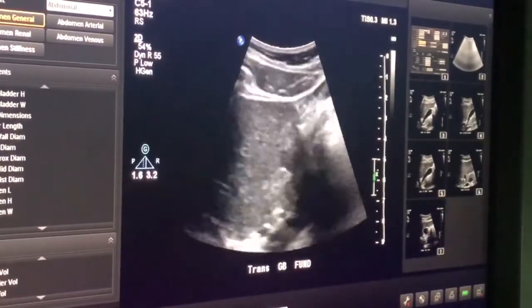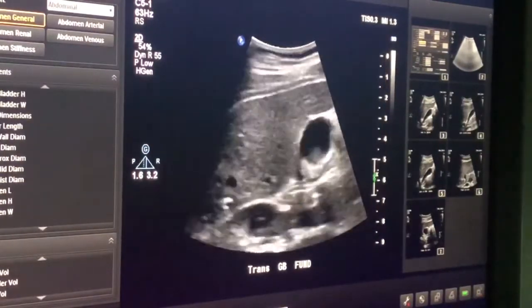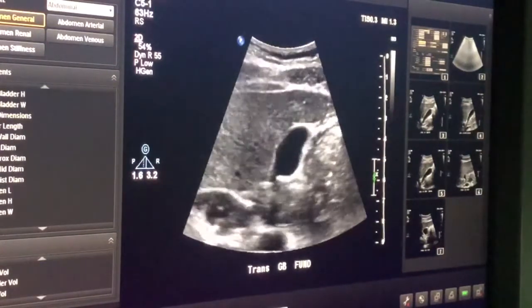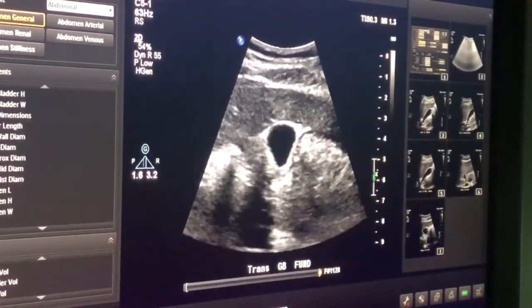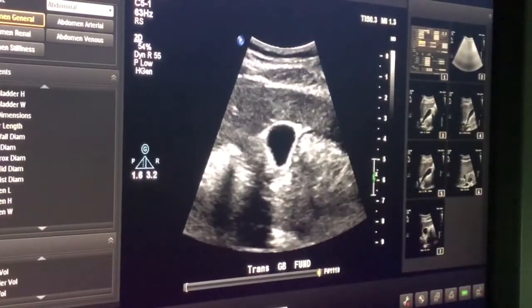I'm going to have the patient take a deep breath in again. I'm going to get my fundus picture, follow it all the way out. I'm twisting my probe to make sure it stays on a circular axis or triangular looking, and breathe, patient. So it's a bit triangular here. You can see the walls all the way around it clearly. This is good.